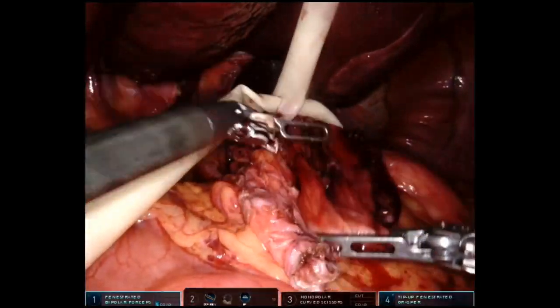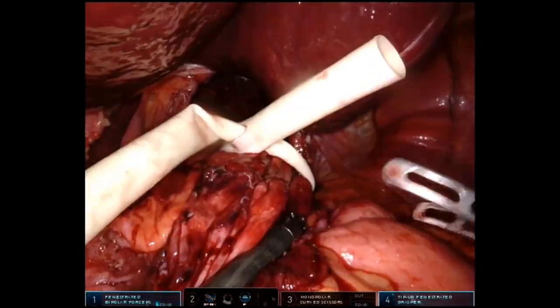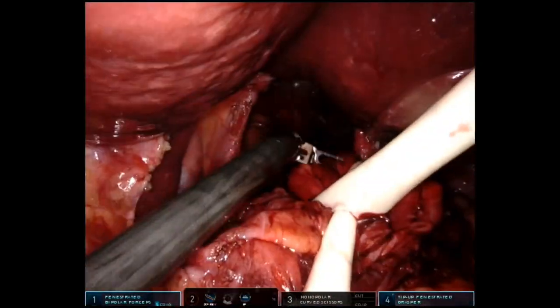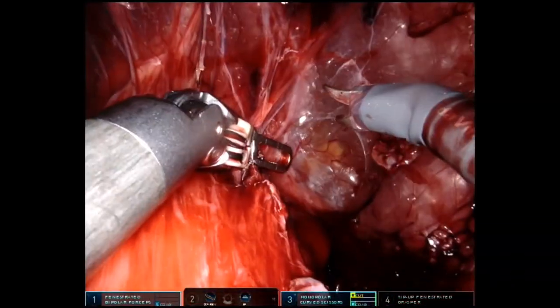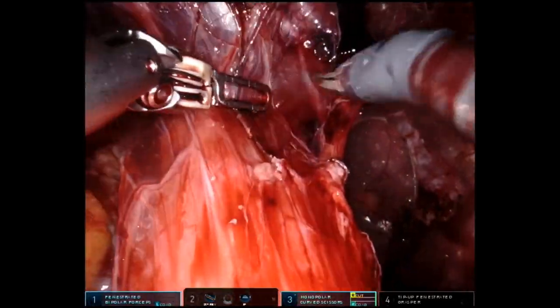That's the hernia sac we're pulling down. Some surgeons take the hernia sac out at the end — I generally do not, unless it's inhibiting a good fundoplication. There's also some further esophageal mobilization anteriorly.